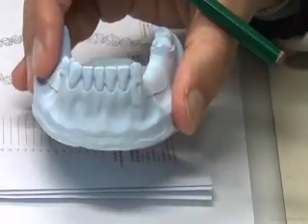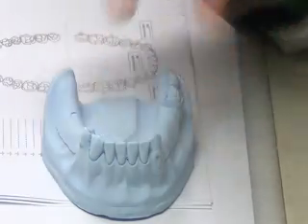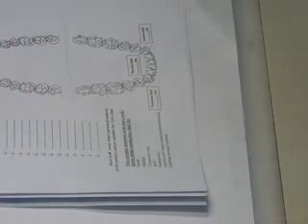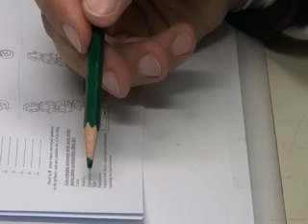It has one color. Can the technician see mobility here? On the cast, can you see mobility? Can you see bleeding or probing? Can you see fillings, especially if they are well done? So I need to scan, especially the abutment teeth very well. And what are the things I might find? Some of these down here. Okay? I might find some caries that I was not noticing.